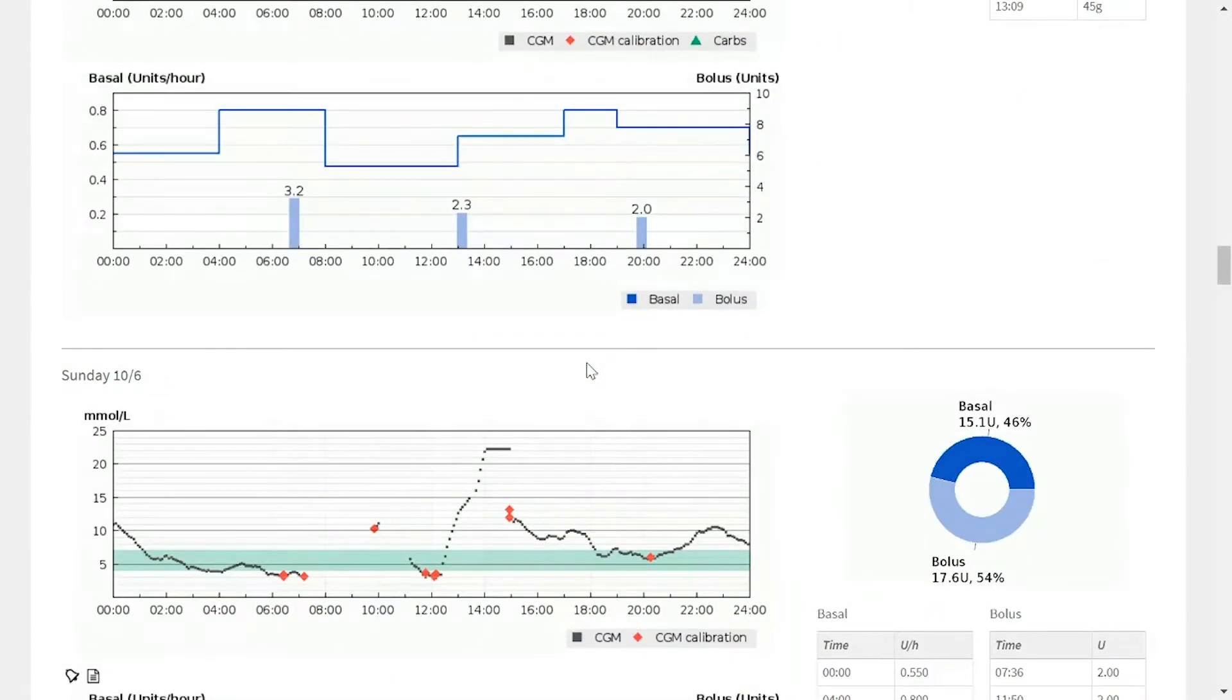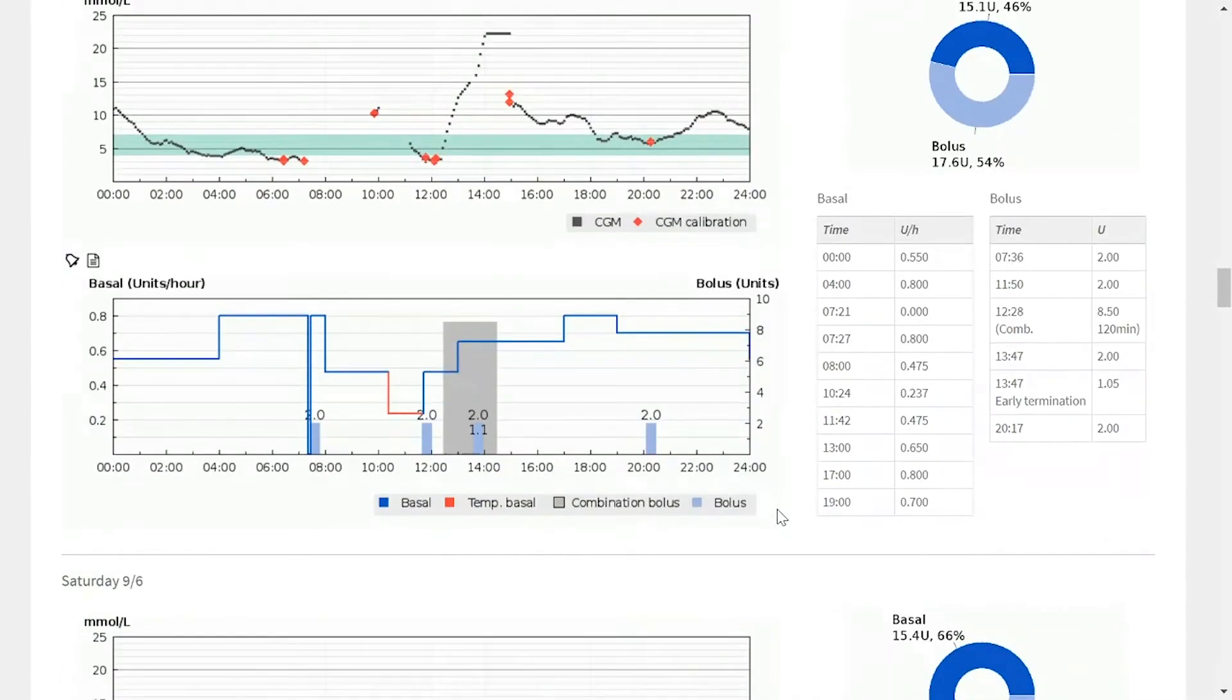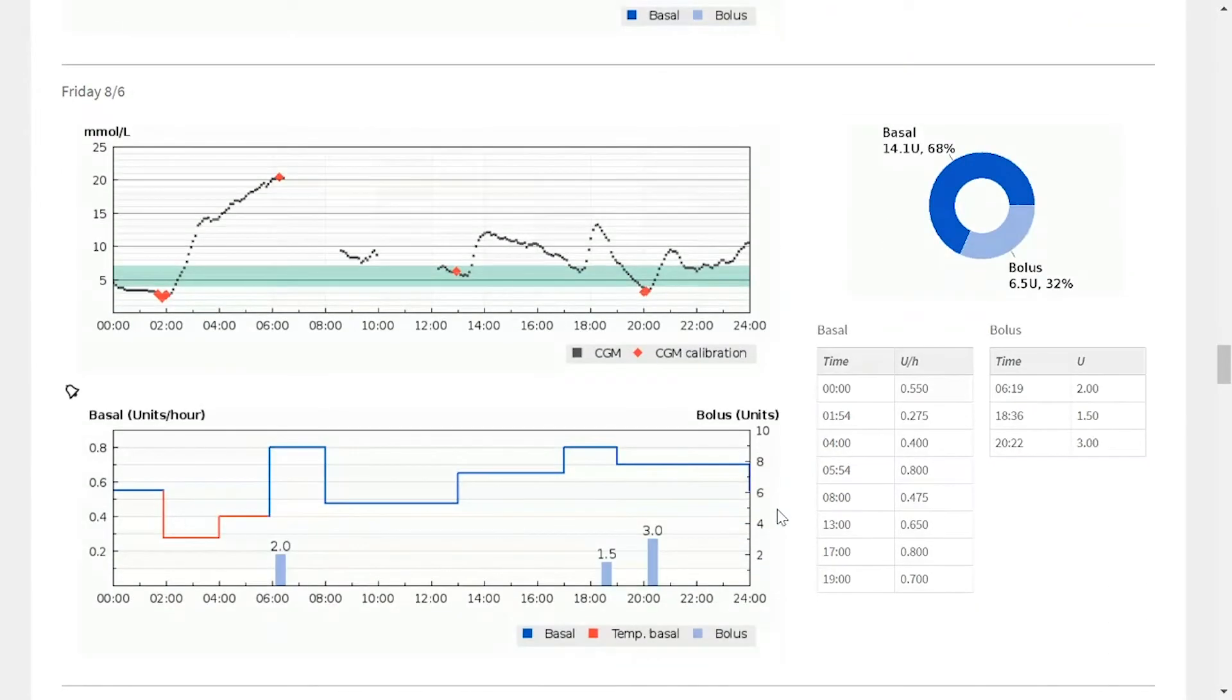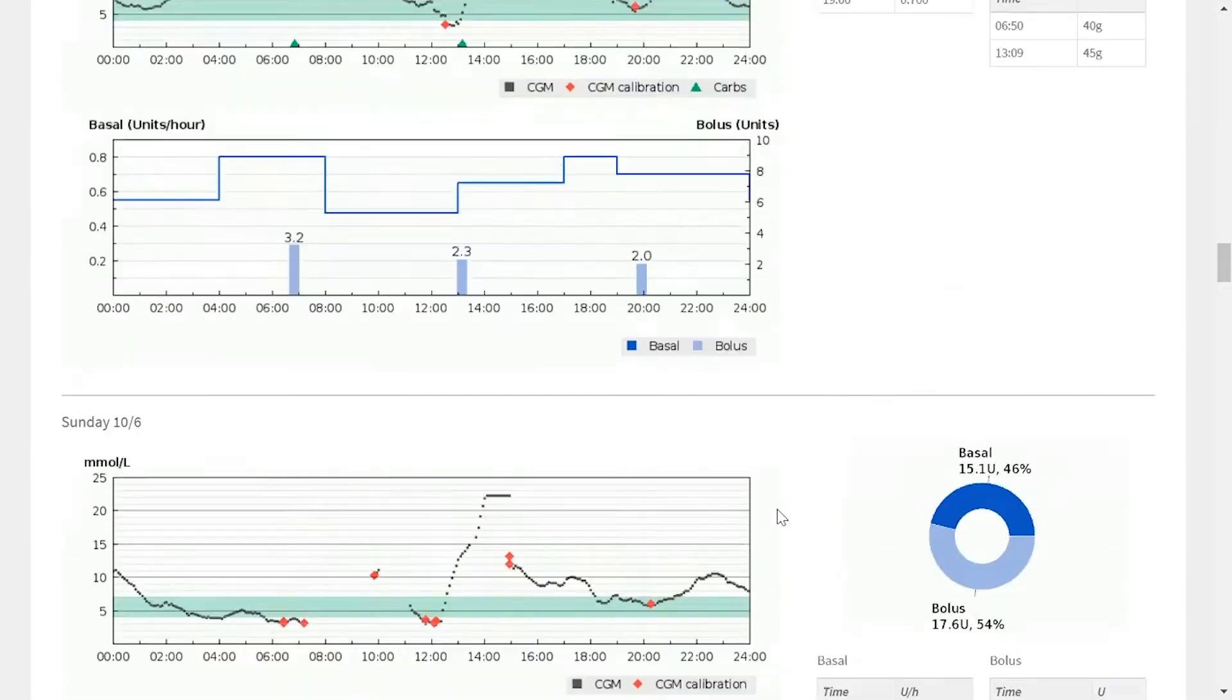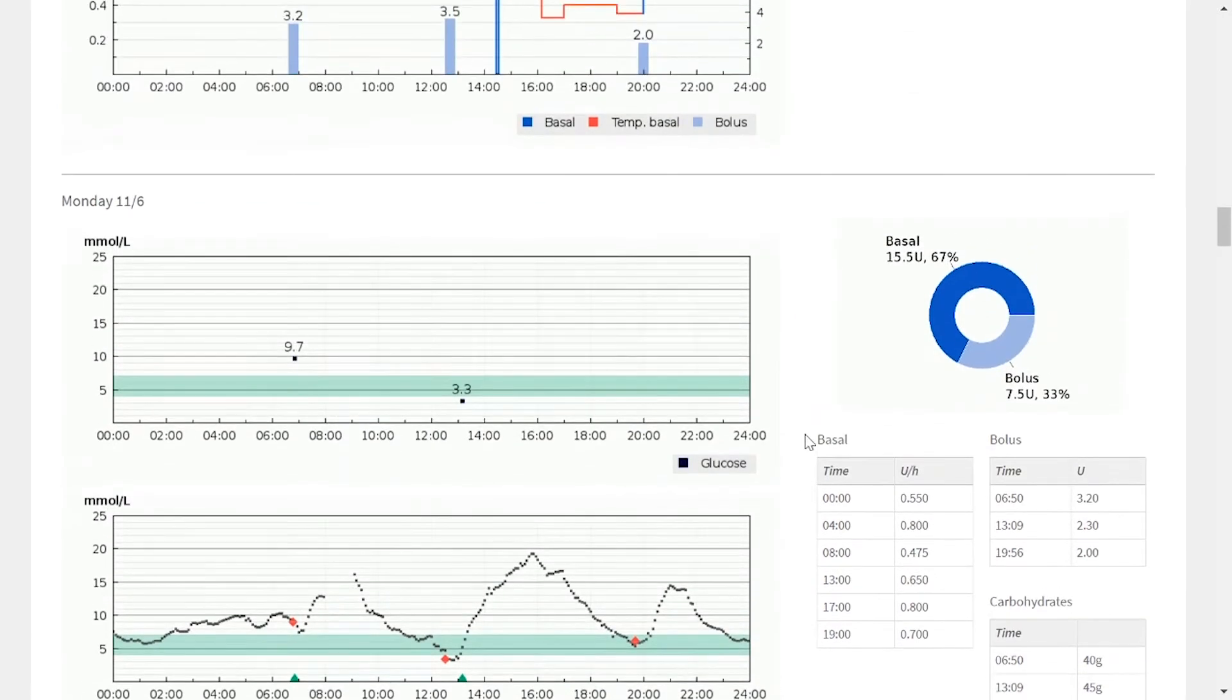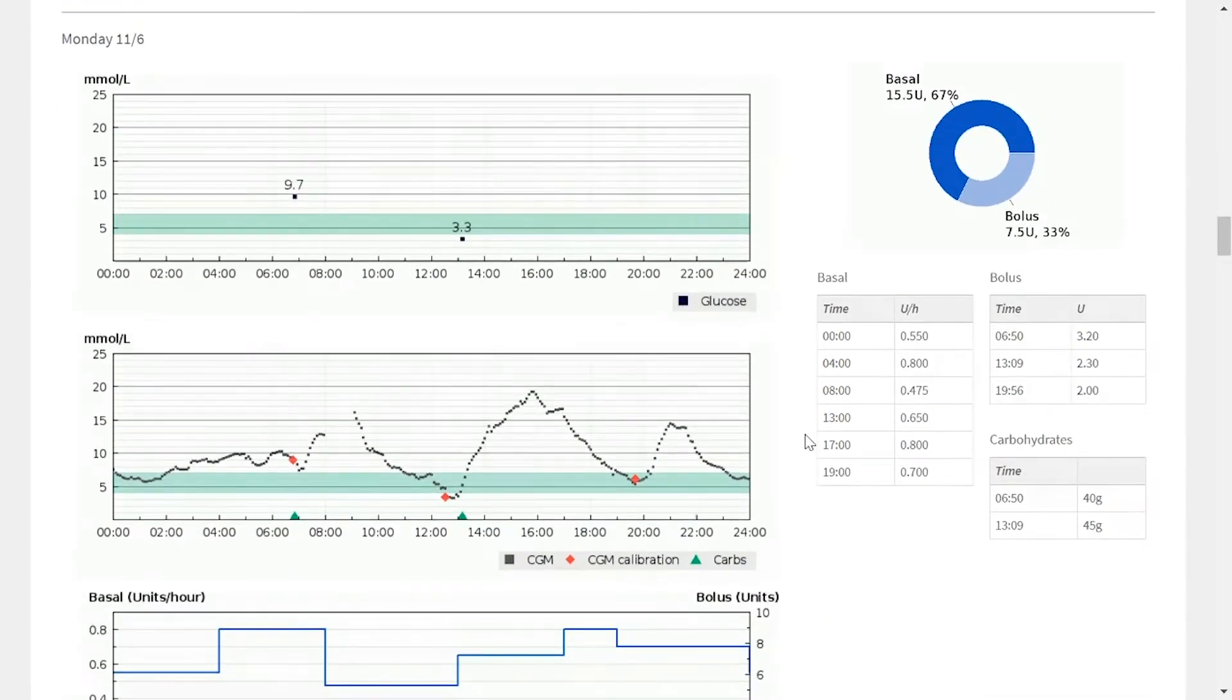Perhaps it coincides with a day where there's increased levels of physical activity. These are all areas of questioning that a clinician may want to explore. And this information can do wonders in helping to ensure that a clinician has all the information they need to make the best possible clinical decision.